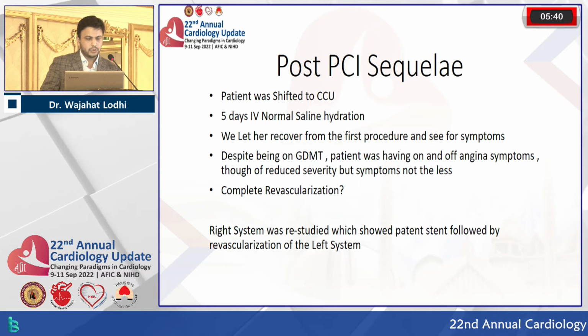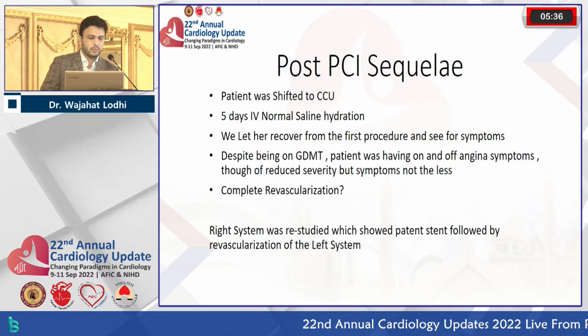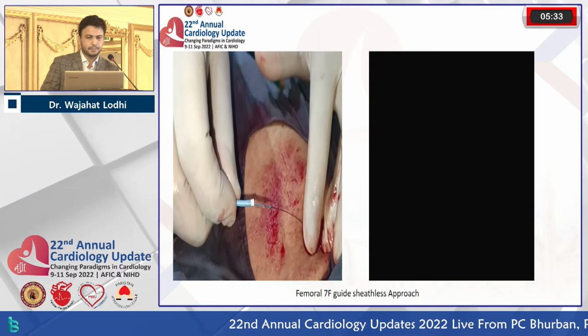We again went in for an angiogram. The right system was restudied. It showed patent stents, good flow, and we proceeded with revascularization of the left system.